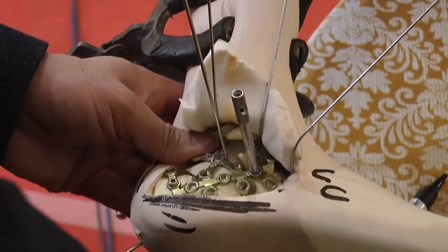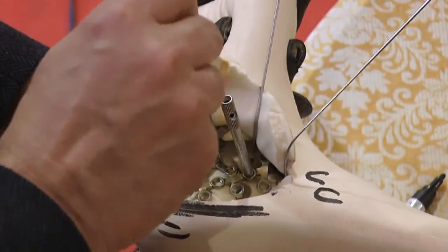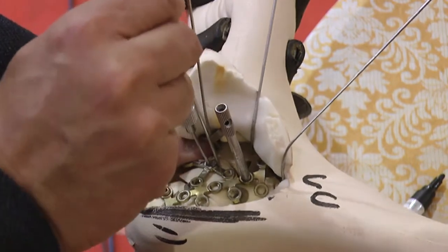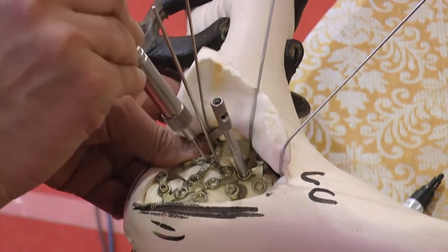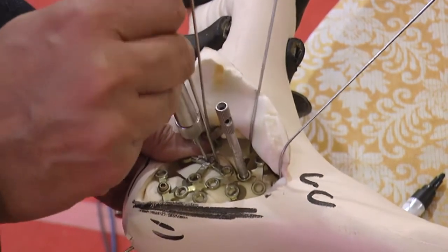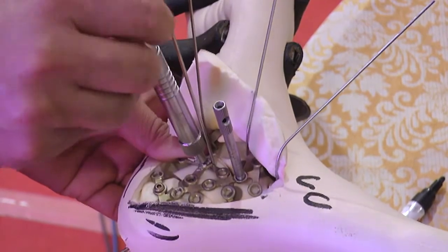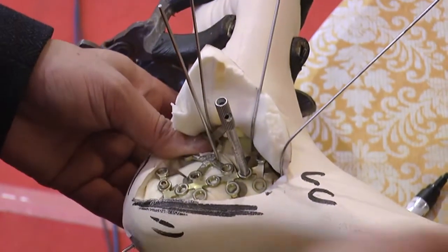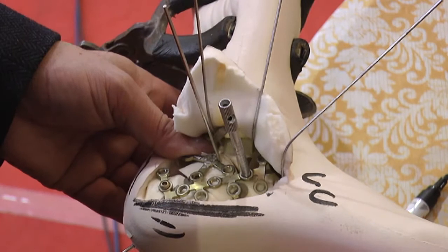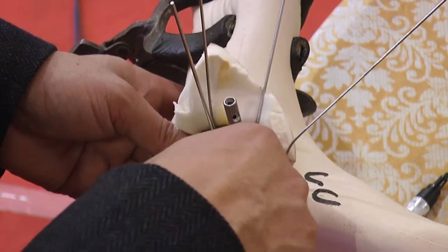In the C-arm, if you've gone about 1 centimeter, you can take an axial and see the direction in which you are going, rather than going all the way and then taking a shot. So you start the drill bit and you take a shot. This 35. And then obviously you will put one cortical screw in the anterior process.